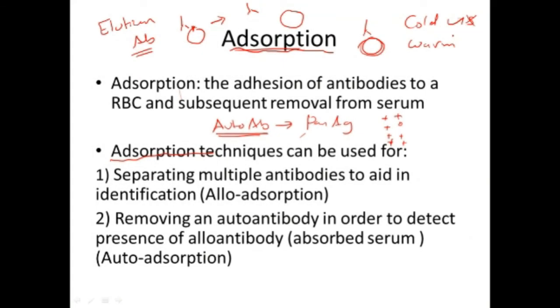Okay, so if you remember, we talk about cold autoantibodies, and we talk about techniques to solve the problem which these antibodies can cause. So we can get rid of or inactivate the cold antibody by omitting immediate spin, for example. طيب. So this is one method. This is a different method. However, we also deal with warm autoantibody. So in this case, it will be quite complicated cases.